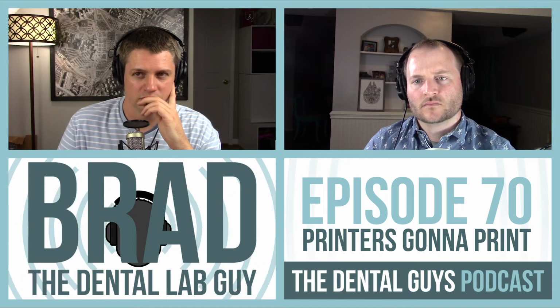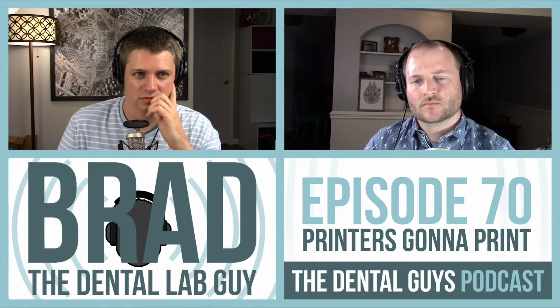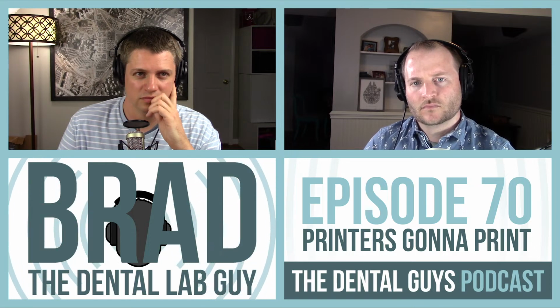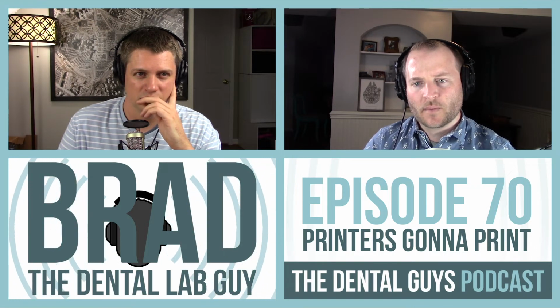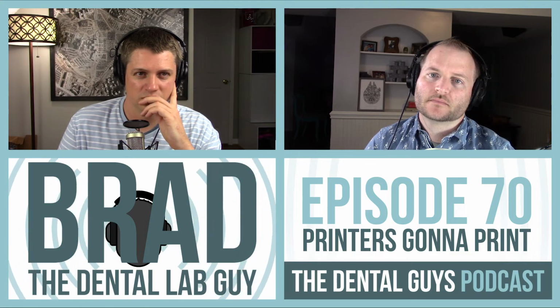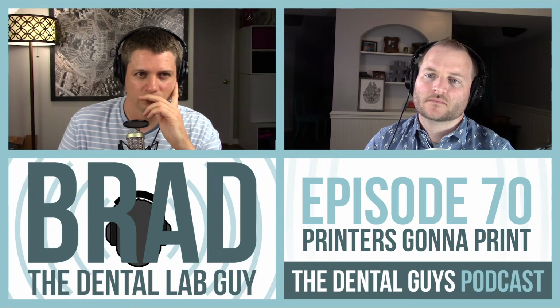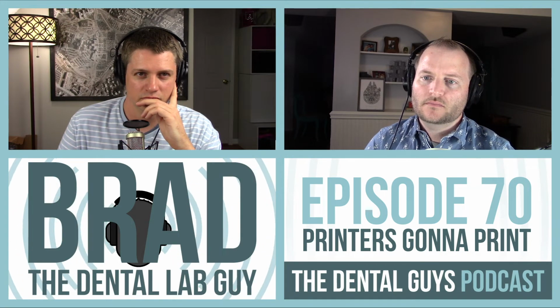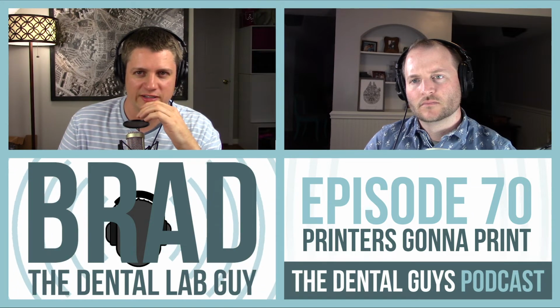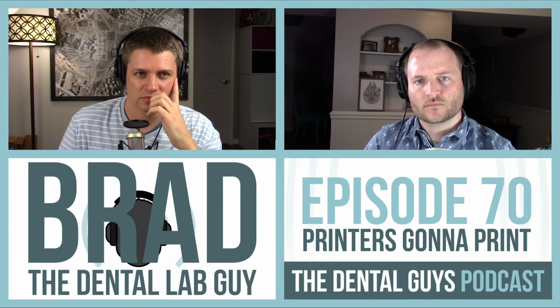Okay. But you said precision guided surgery. To do precision guided, number one, you have to have a metal guide tube processed in your surgical guide. To be precision, you can't just print a hole with resin printing. We're talking precision guided, where you're guiding the implant all the way through the surgical guide. So you would have to get the precision guided metal sleeve from whatever company makes this part, and then you're going to have to get their STL file to be able to import that into your software.